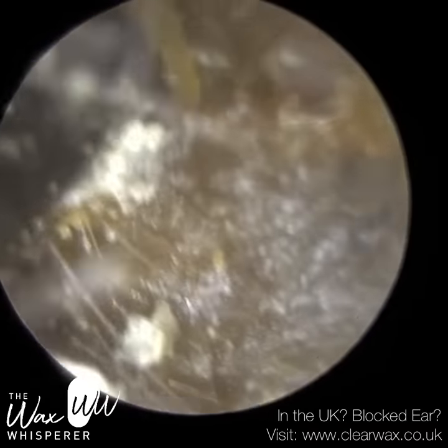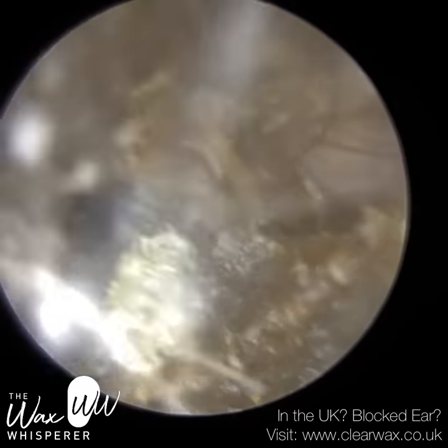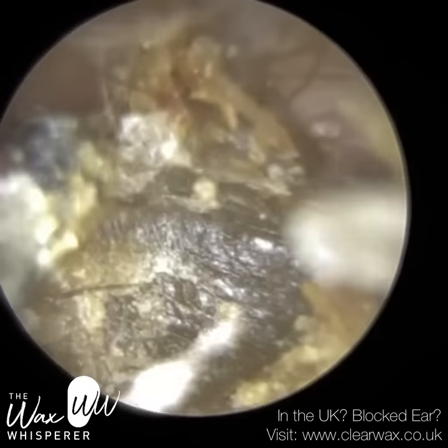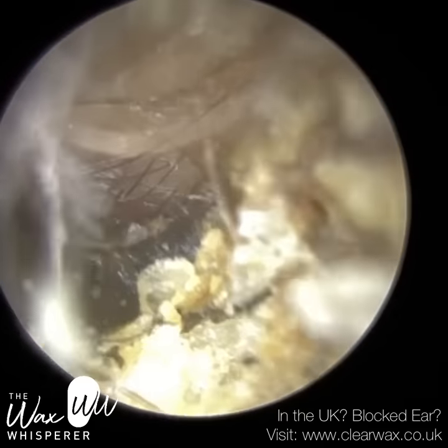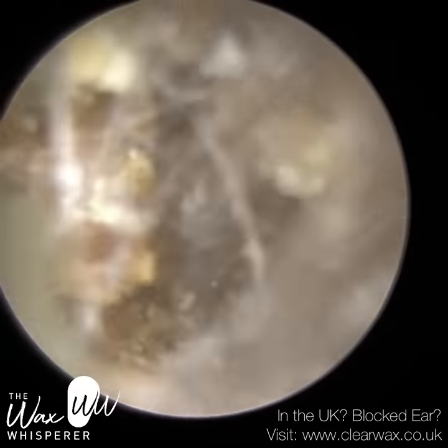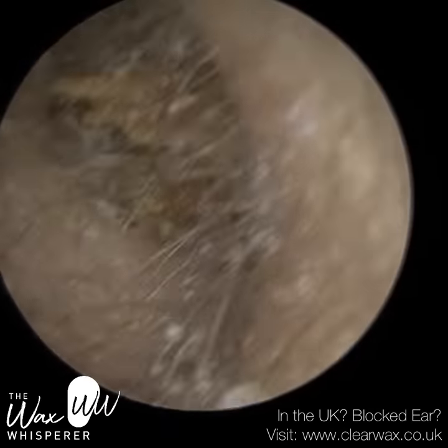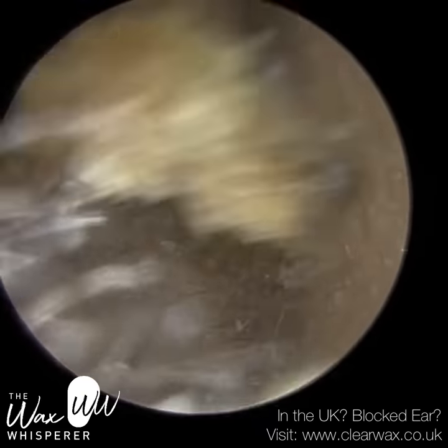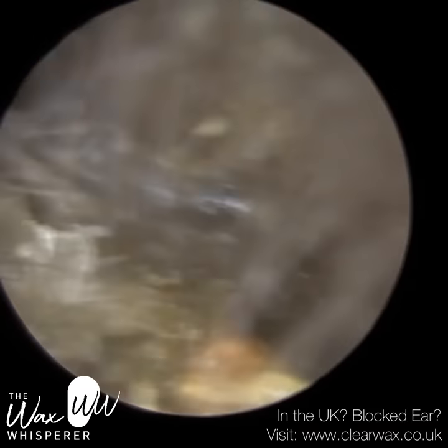I'm going back to the hook, trying to go to the roof. You can see this is really heavily impacted — the wax has fully occluded the ear and is beginning to expand and compress against the ear canal walls. Even with the hook, we're having a bit of trouble releasing this. I've just managed to separate some of the wax from the roof of the ear canal, using the Jobson horn to glide in before rotating the hook to get some purchase and grip into the wax.